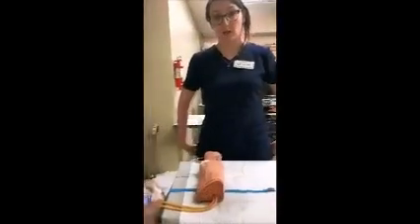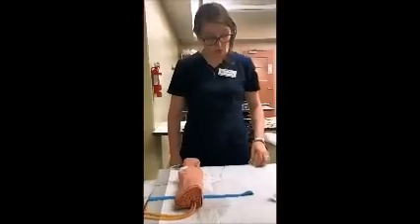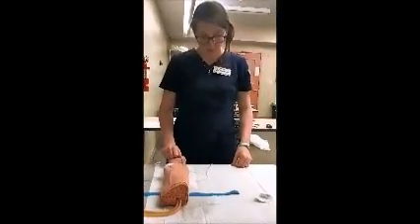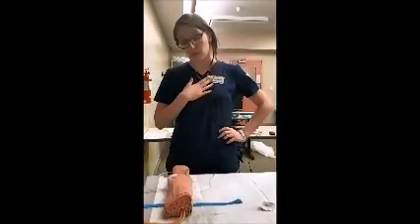Okay, so we got 7 drops in 20 seconds, which is going to equate out to 21 drops per minute, which is our drop rate. So that's good. Going to check in with Joe, and we're going to do a little patient teaching. I'm a big fan of patient teaching, Joe.